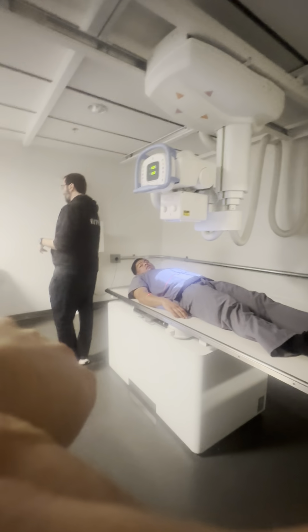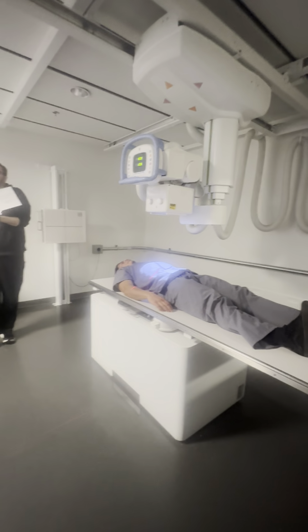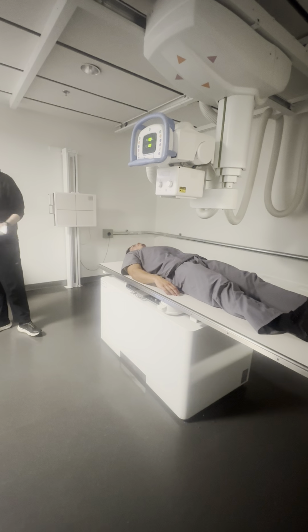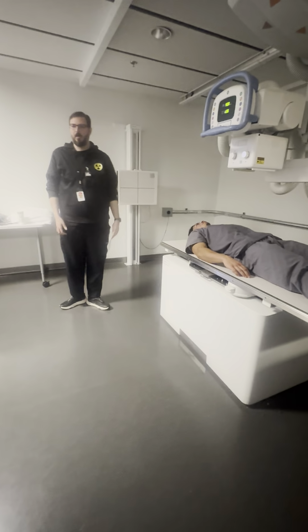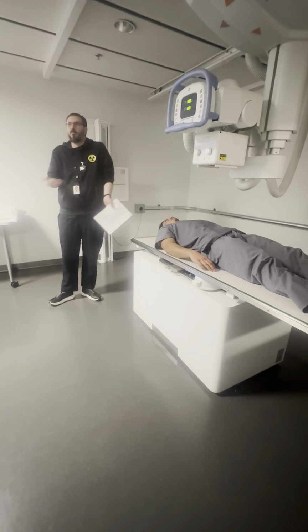So if you look at the sheet, it only has the one view. It just says AP or PA. Should we do AP or PA? Small bowel. No, PA. It's closer to the. Yeah, PA, because the intestines get closer. Absolutely, we're not going to do it.